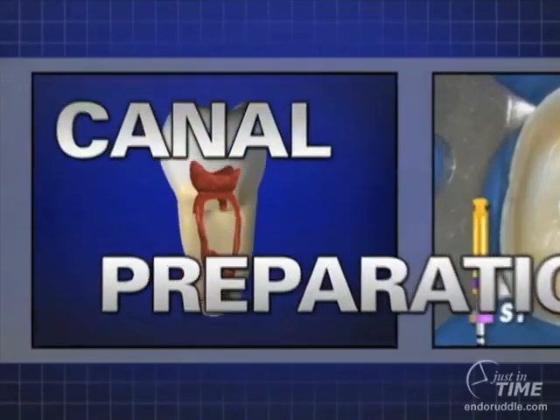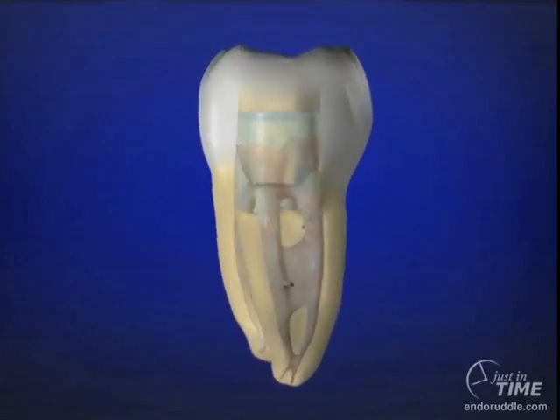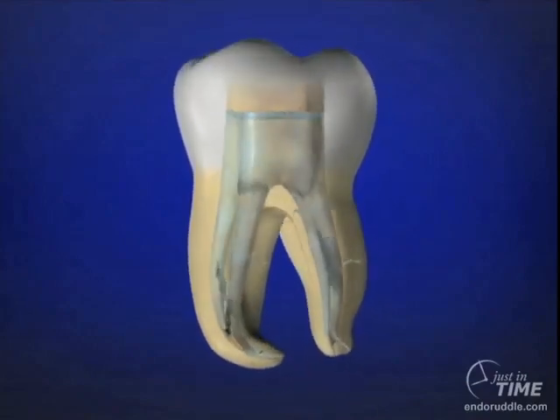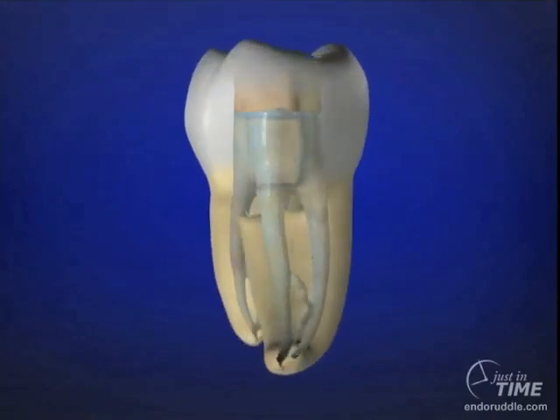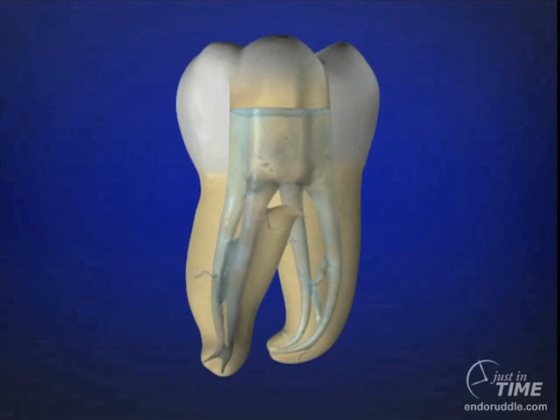But when you think about the micro CT work that we see in various textbooks and online around the world, some of these systems are very complicated and formidable. Our job is always the same: a complete access. And then, of course, we have to catheterize the canal and create a smooth, reproducible glide path. So all my discussions about shaping are limited by the assumption that you have a glide path. We talked previously about the instances where you have a reproducible glide path versus when you have an irregular glide path, and those have different management schemes.